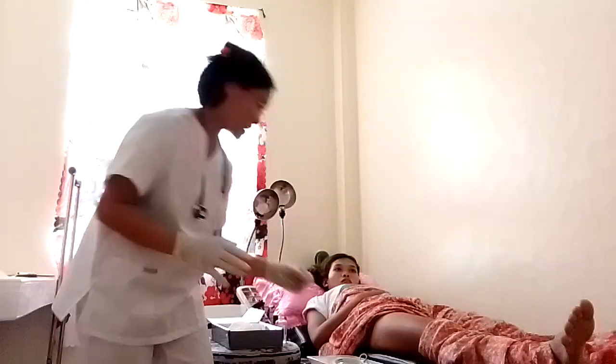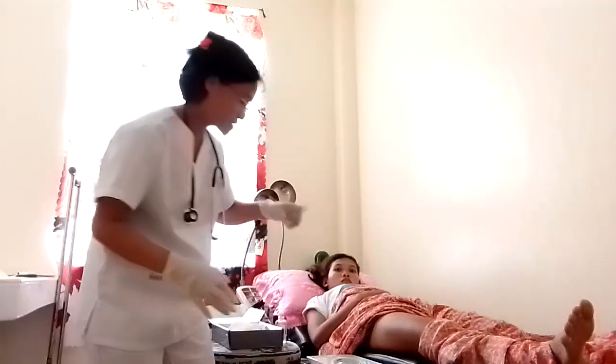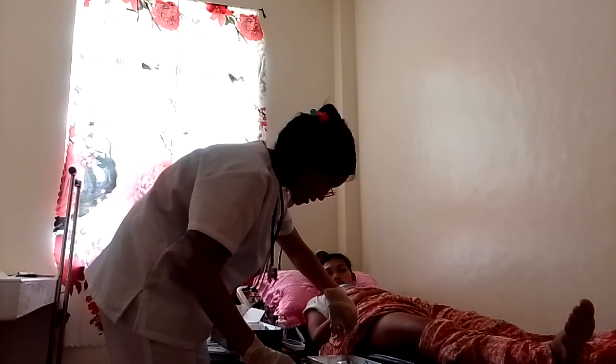Use separate swab for cleansing stroke. Okay? So, kailangan dyan ta maglimpyo na ta sa mad sa ato ang pasyente. We need to use separate swab for each cleansing stroke. So, for this one, magamit ko og working forceps. And then also, cotton balls. Okay, so kailangan na siya solution nga naputang. Okay, so I have here working forceps. Okay. Okay, so magkuha lang ko cotton balls.